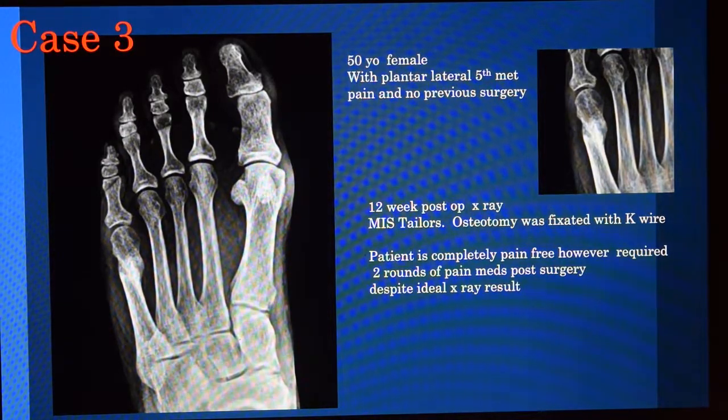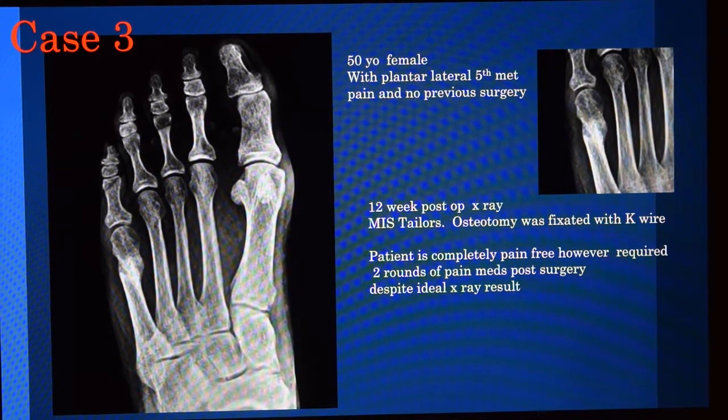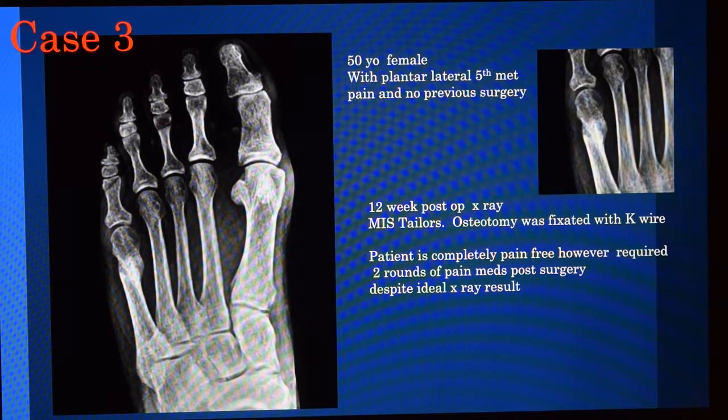Case 3, this is a 50-year-old female with plantar lateral fifth met pain, the same as the other person. This is also a 12-week post-op. MIS Tailor's, the osteotomy was fixated with a K-wire. So this patient is completely pain-free as well. However, she required 2 rounds of pain medicines post-surgery despite ideal X-ray results. So you see good consolidation there. The X-ray at 12 weeks really looks good because we did fixate this with a K-wire.